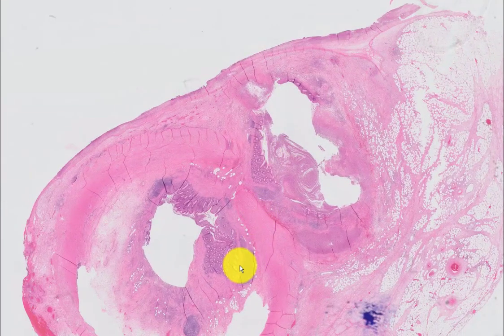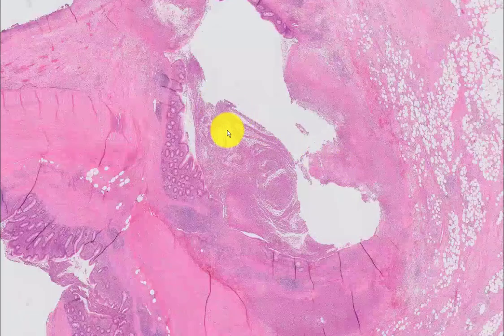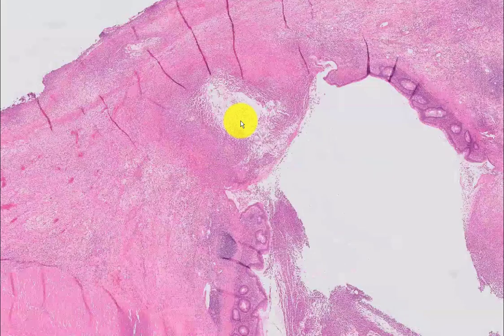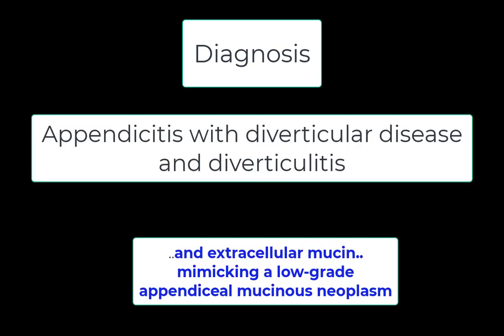To sum all of this up: this is acute appendicitis involving the native appendix with an appendiceal diverticulum. The diverticulum has diverticulitis, and that diverticulitis has resulted in the production of a small amount of extracellular mucin. In some cases this mucin could dominate the picture, but in this particular instance it appears as a sideshow. In instances where the mucin dominates the histologic picture, lesions such as this could be mistaken for a low-grade appendiceal mucinous neoplasm.